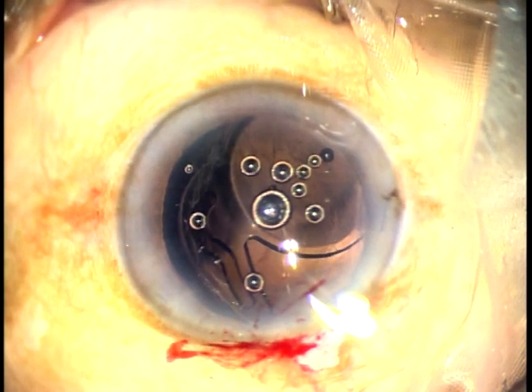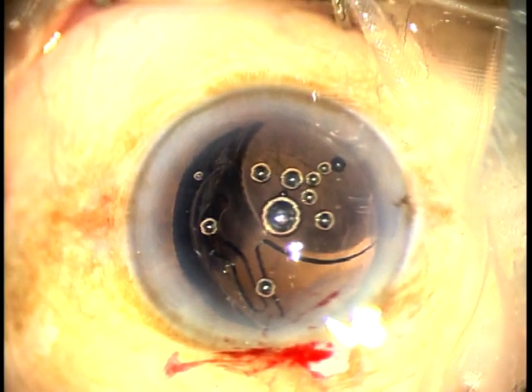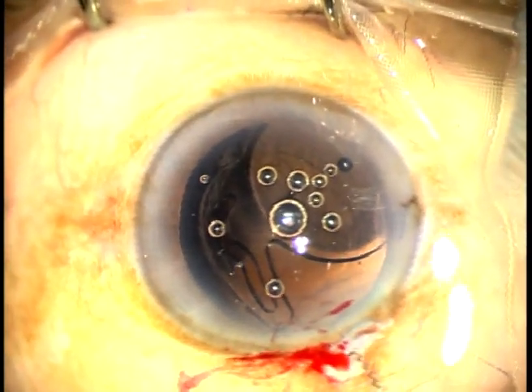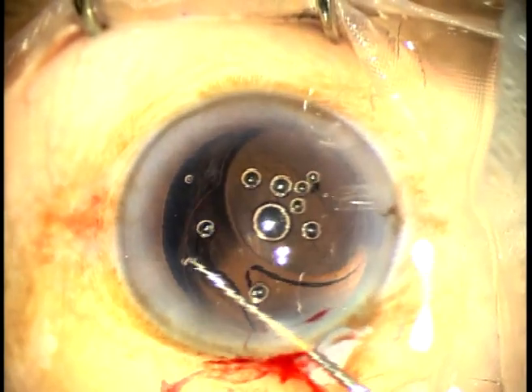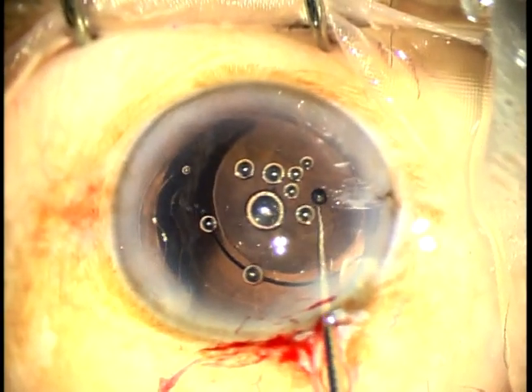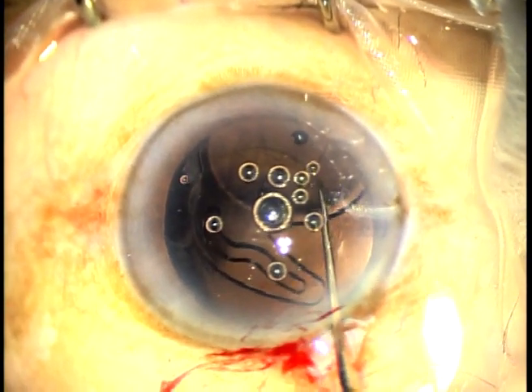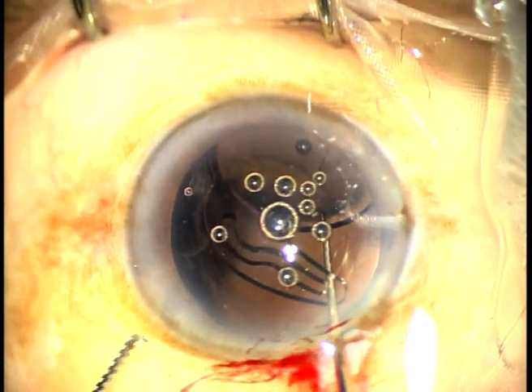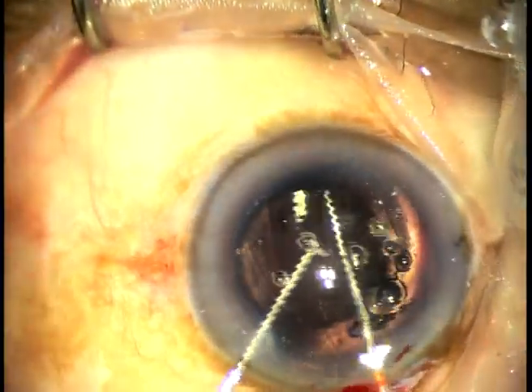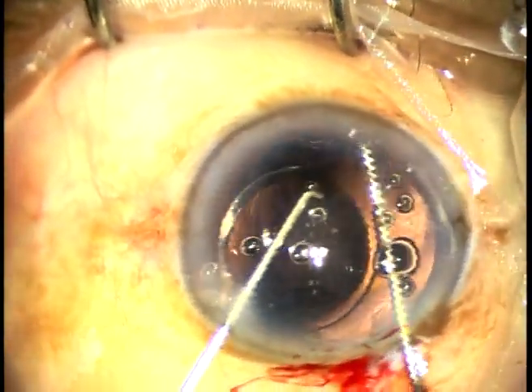So at this time, I saw that the lens is displaced and part of the lens is in the anterior vitreous. The posterior capsule has been torn. So I asked him to let me take over and manage the case henceforth. I am using two instruments and retrieving the lens from the anterior vitreous and placing it over the iris.